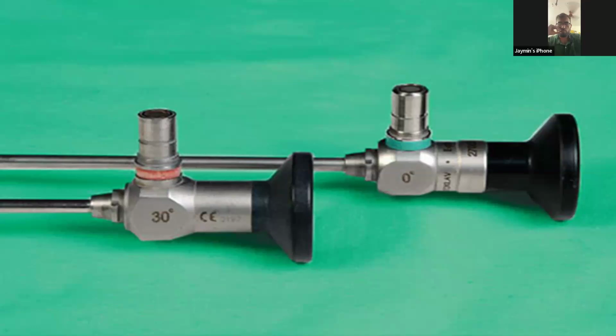Field of vision, and angle of vision is 30 degree only. So that is for the posterolateral area. Then comes the 70 degree. It is for the dome of the bladder. And then comes the 120 degree one. That is the bladder neck, anterior surface and neck of the bladder.